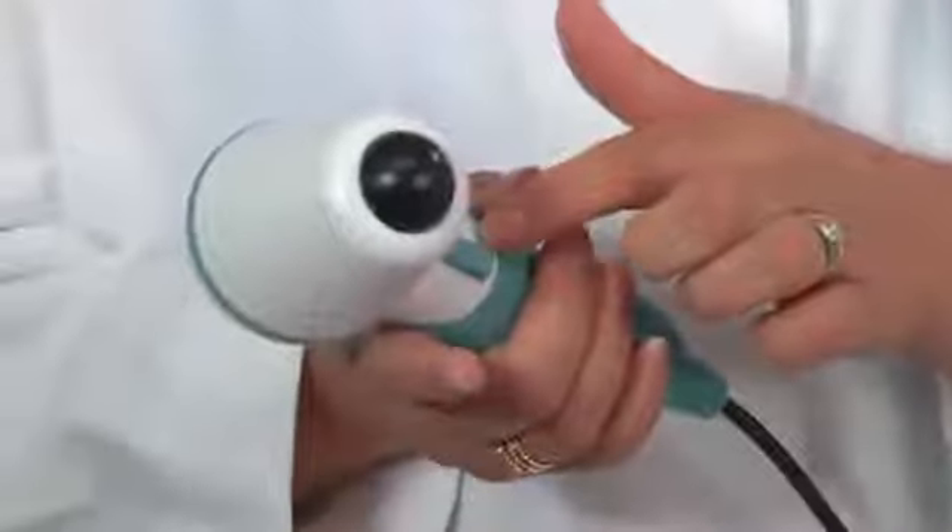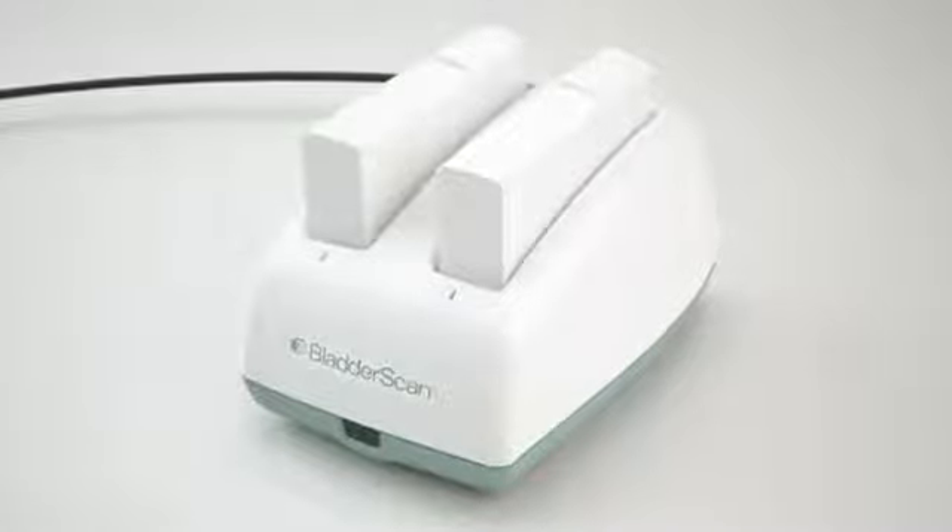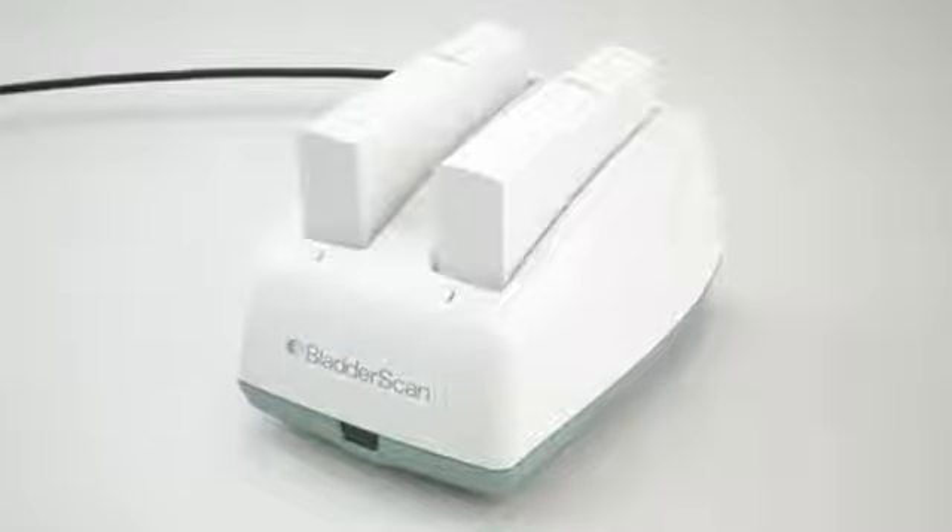It also has an ultrasound probe that scans the patient's bladder and needs to be wiped with alcohol between patients. This is the button that is pressed to perform the scan. The bladder scan has a combination battery, charger, and wireless hub. It comes with a manual and I recommend you review it before you use the device.